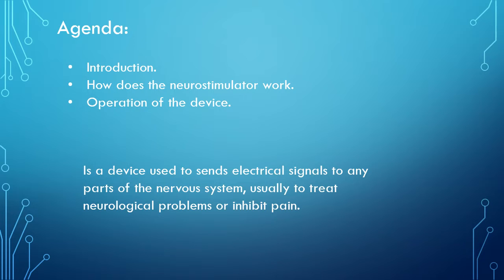The agenda of this presentation is, first, I will present a brief introduction. Then I will talk about how the neurostimulator works. The neurostimulator is the core of the nerve stimulator device, and then I will conclude by presenting the operation of the nerve stimulator.